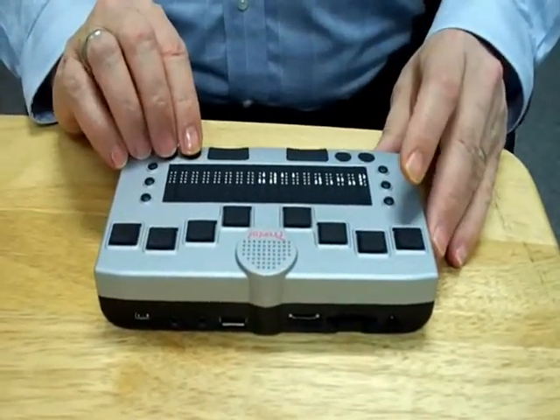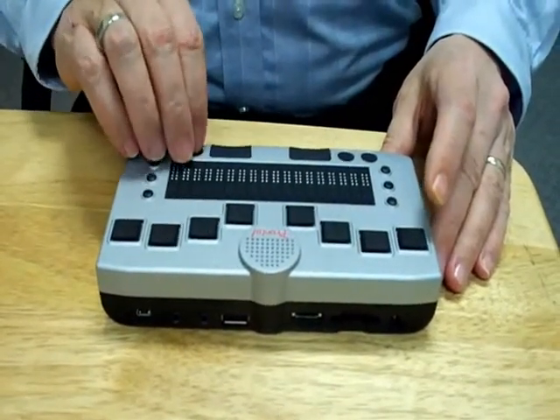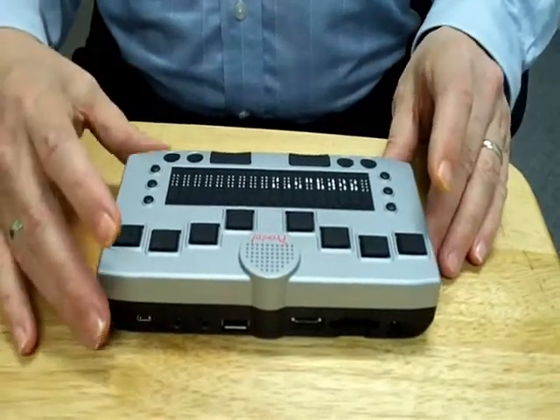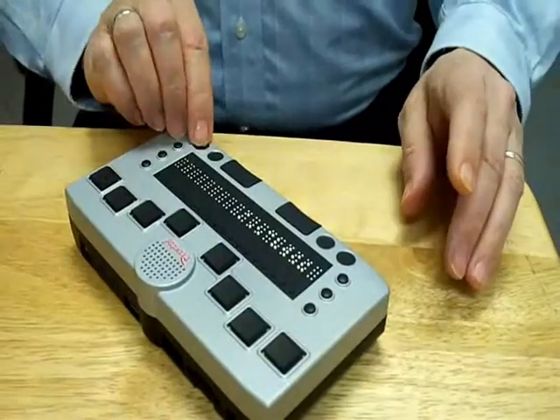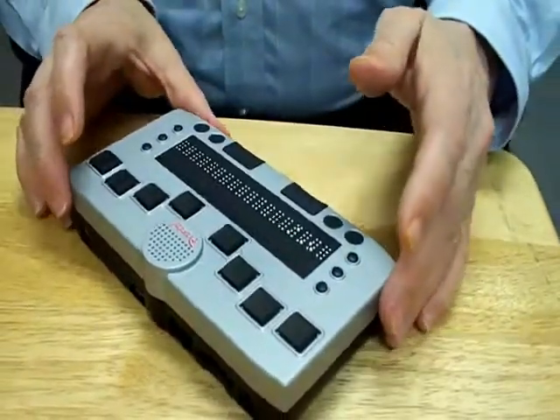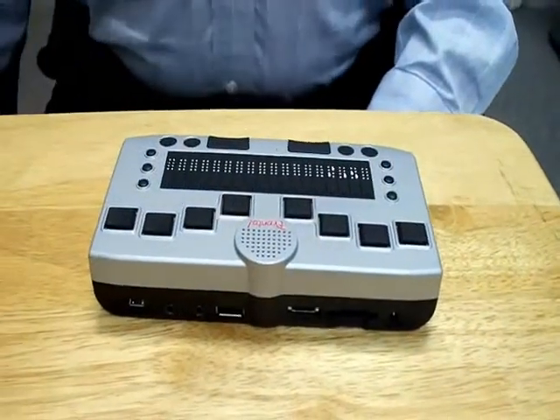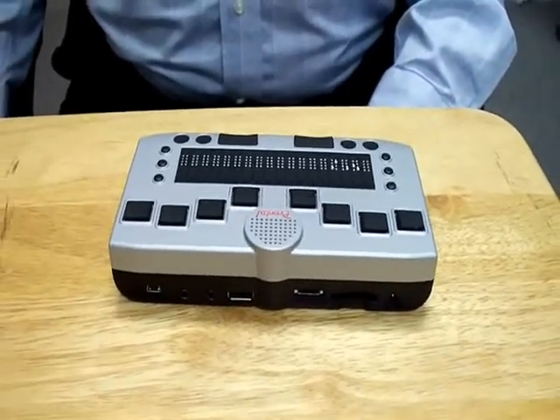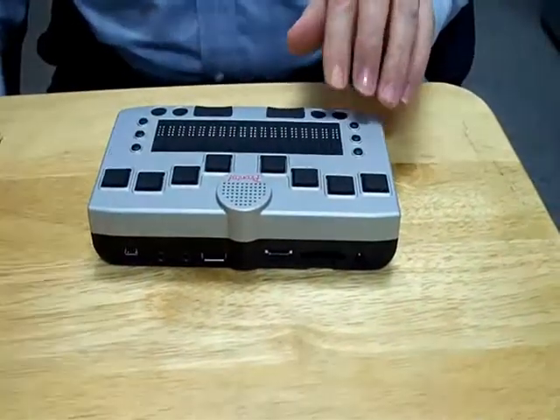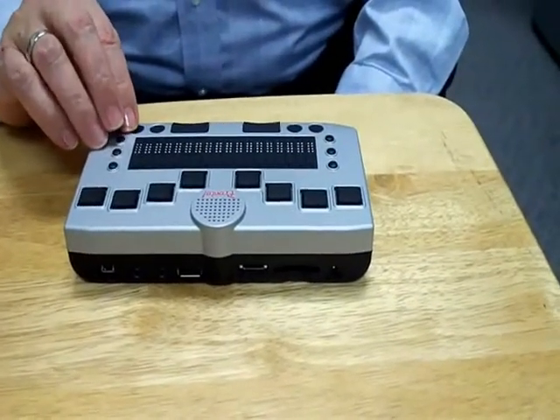For example, Pronto has a built-in compass. It can tell you the direction that Pronto is facing right now. Northeast. Okay. If I move the unit, East. Okay, so you see it has a built-in compass. And it does have a built-in altimeter and a built-in barometer as well that you can hear values for when you tap these keys various times. To get the time, I pressed S4 once. To get the date, I pressed it twice.